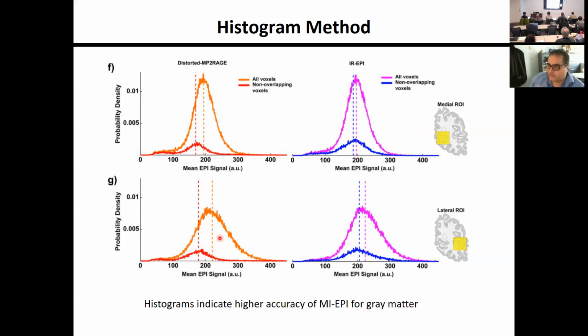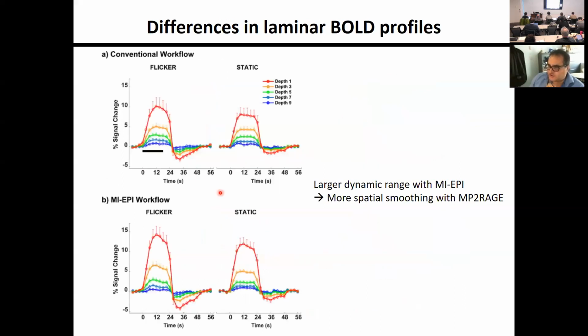So next slide. This is now just registration, but let's look at what comes out when we do the functional MRI analysis. This is shown here, and this is from the paper from Kashyap et al. I will not go too much into explaining what we did there, but this is now based on the MP2RAGE, which we call the conventional workflow, and this is with the distortion matched anatomy. This is from the same data.